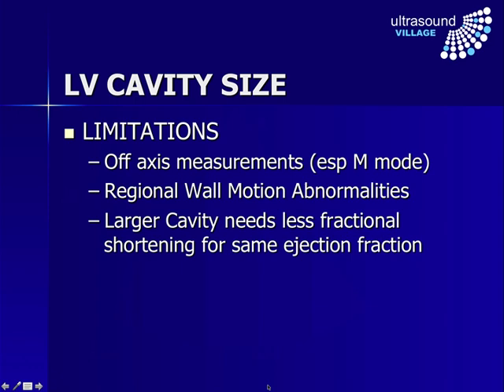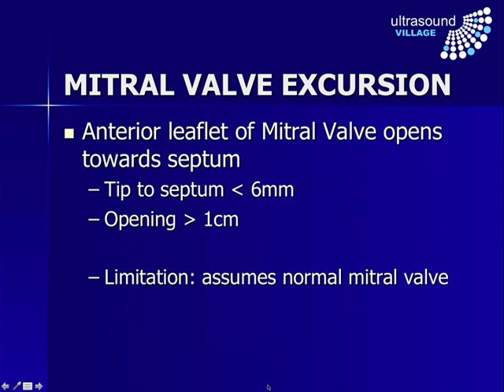What are the other things we can look at to help confirm our estimates? One is the mitral valve excursion. Looking at the anterior leaflet of the mitral valve, it opens up towards the septum — normally the tip of that valve will go to within less than six millimetres of the septum, and the overall opening between the anterior and posterior leaflets is greater than a centimetre. If there is greatly reduced cardiac output and flow through the heart, the valve won't open as fully. This assumes a normal mitral valve — if you have mitral stenosis, for example, the valve won't open fully due to valve pathology rather than poor function.